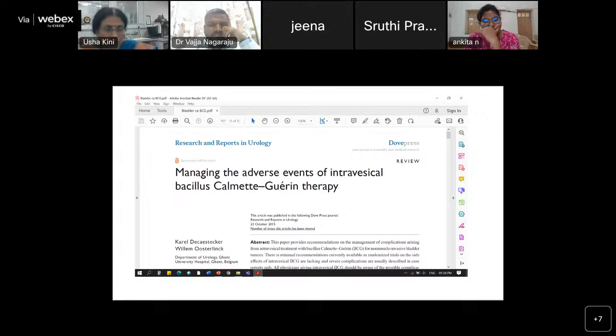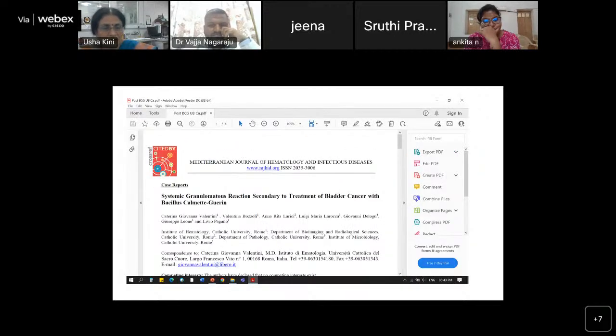purely for onco purposes. So these are nice, good articles, to tell you that whenever you see a granuloma, wherever they be, in each organ, it's a different story. So it doesn't mean if you see granulomatous, it becomes tuberculosis. So all that glitters is really not gold. Okay. So we have seen granulomatous in various organs, various situations.